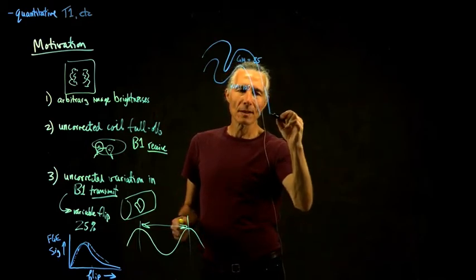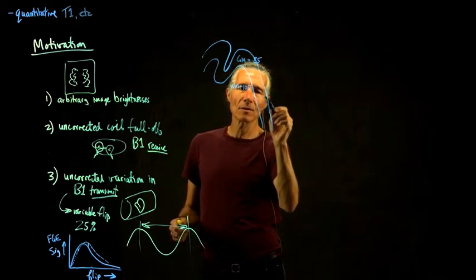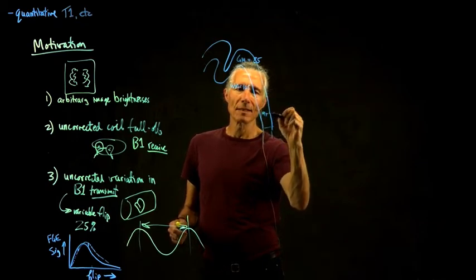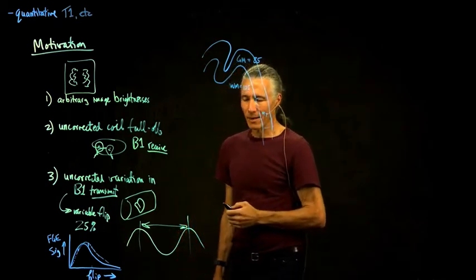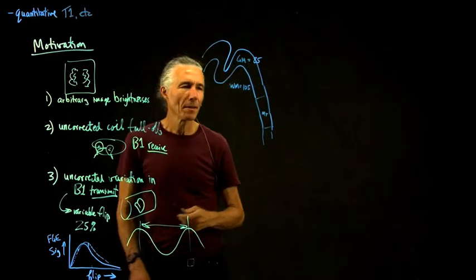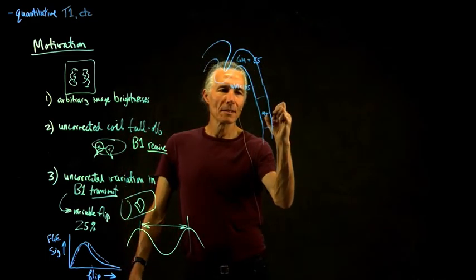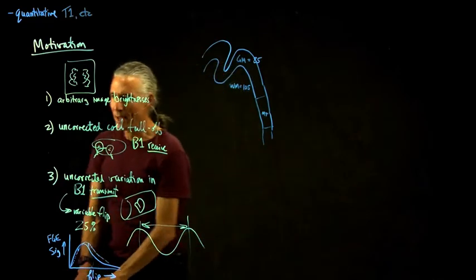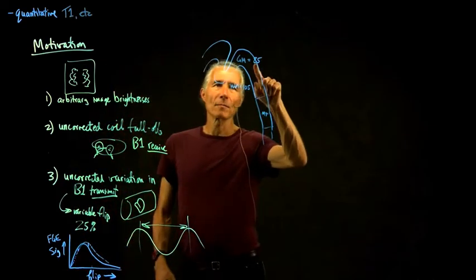But what about looking at different parts of the cortex? So we know that, say, MT, for instance, is a myelinated area. And a myelinated area tends to look a little bit more like white matter, which means that it will be a little brighter.